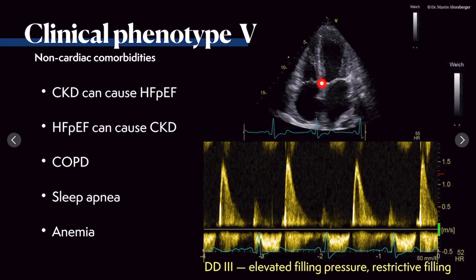We have a diseased left ventricle, a diseased left heart, and we have this restrictive filling pattern — a very high and steep E wave and a very small A wave.